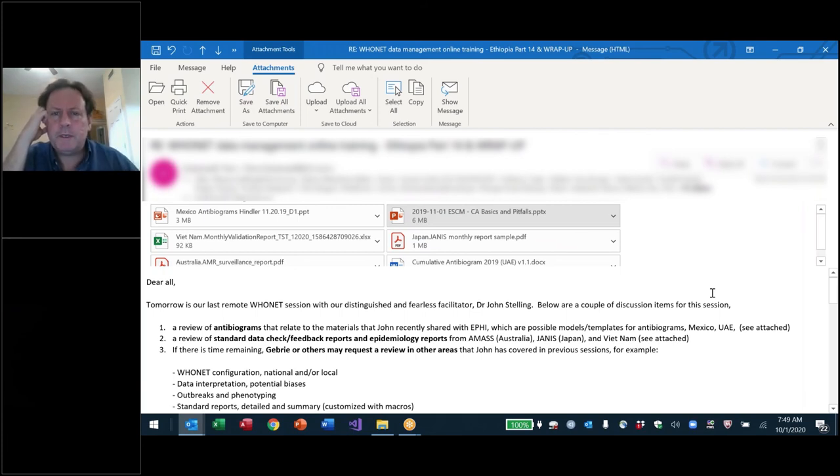If it was taken in the community, we're calling it a community sample, and we will also call it a community infection for WHO reporting. That's simple to do. It's not always correct, but it's simple to do. And that's the WHO recommendation.